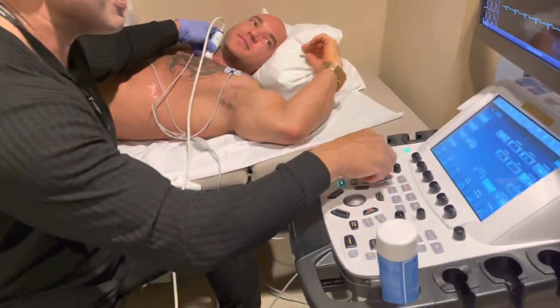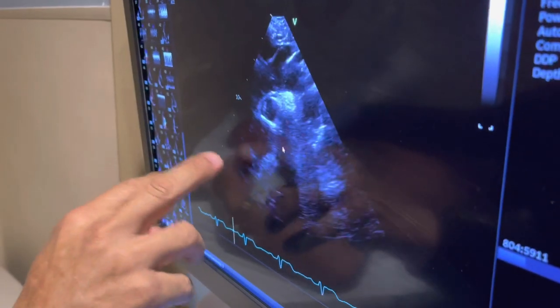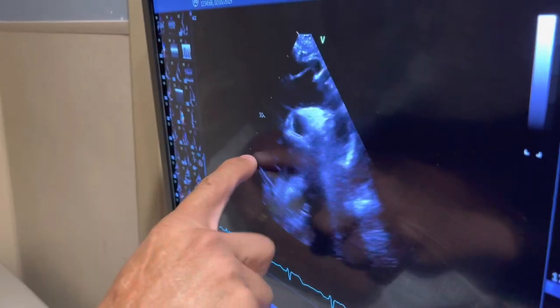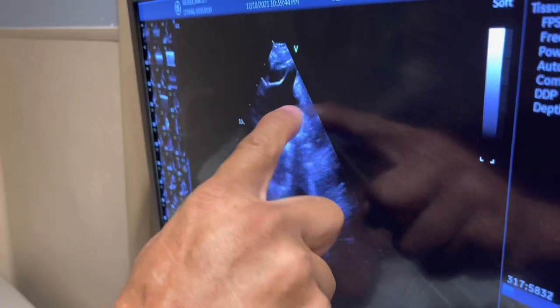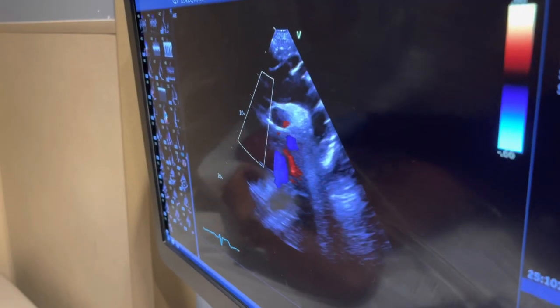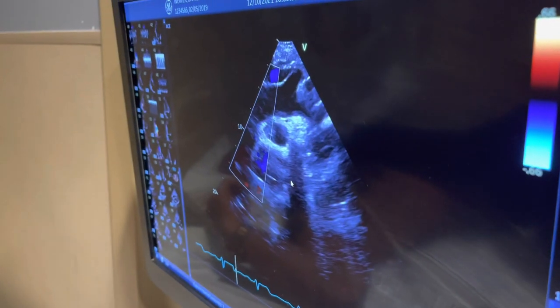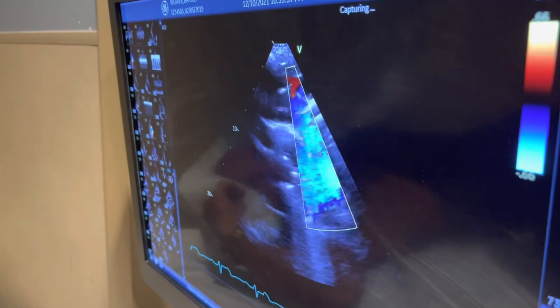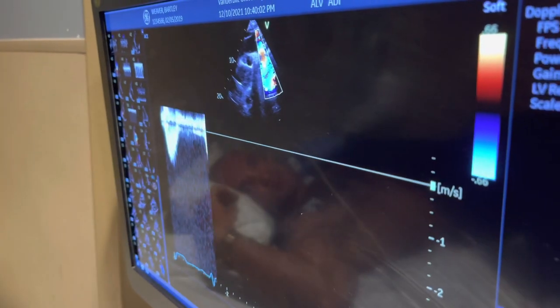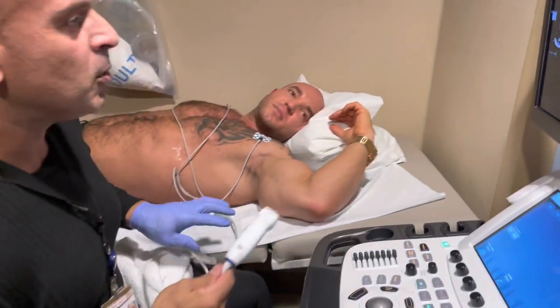The last image — this is your aorta. The heart is down here, the aorta brings up the blood — that's the main blood vessel we saw in the beginning. It brings blood up to the brain through these vessels, then descends down to the body. This is the descending area. We can see the flow coming up from the heart, and we're going to Doppler this region to make sure the flow is normal.